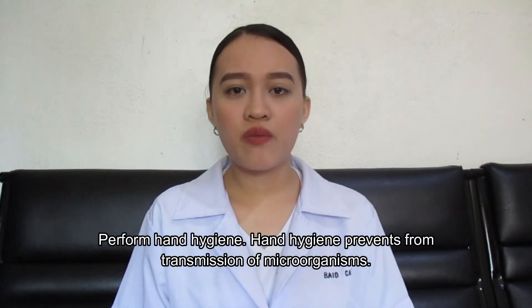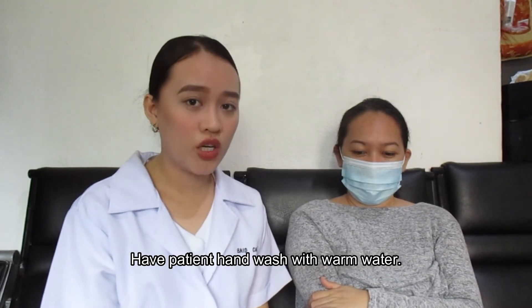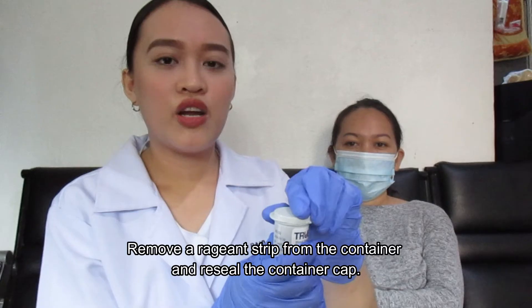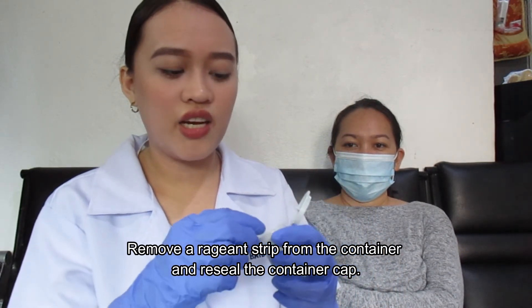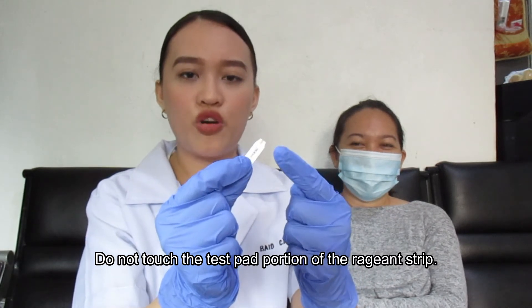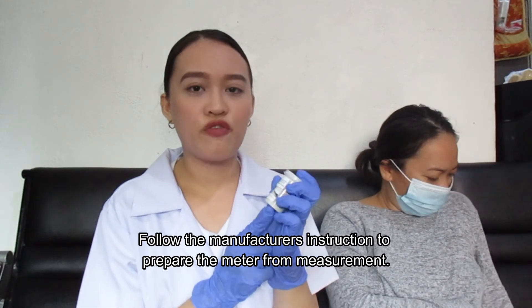Perform hand hygiene, as it prevents transmission of microorganisms. Have the patient hand wash with warm water or clean with an alcohol swab. Remove a reagent strip from the container and reseal the container cap. Do not touch the test pad portion of the reagent strip.